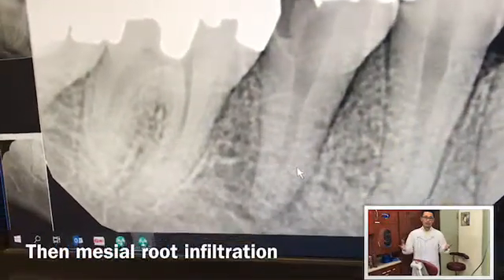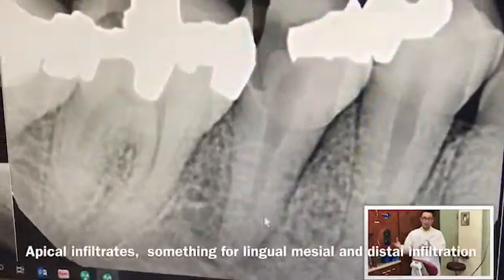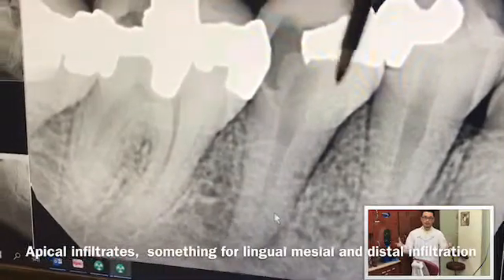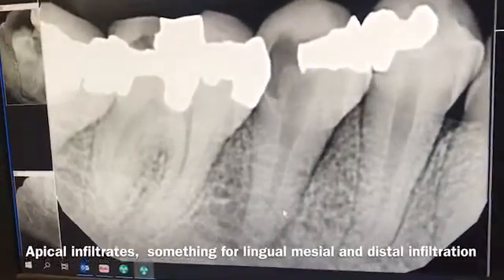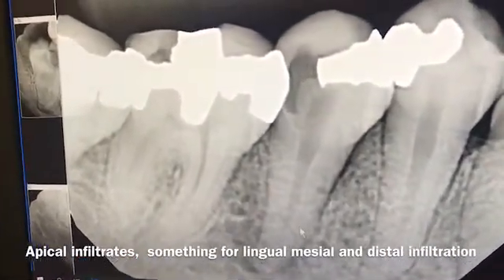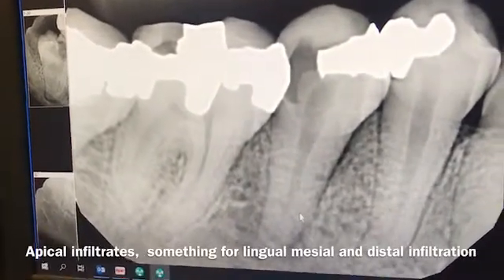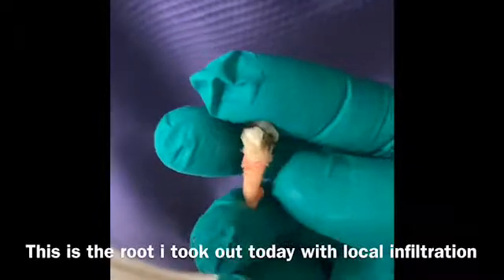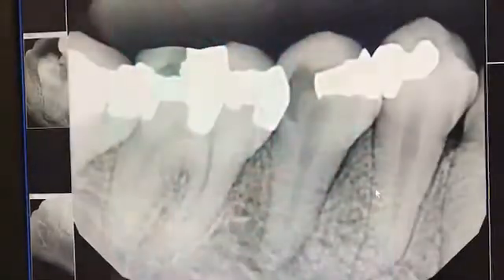The way it works is you numb a few spots. Number one, you numb at the distal portion — bend the needle and start at the distal, then numb on the mesial, and then numb on the farther distal of the tooth, like at the molar area. Then on the lingual, you do the same: mesial, distal, and apical part of the tooth. Wait a total of about three to five minutes, and I was able to take out this tooth without doing an IA block.